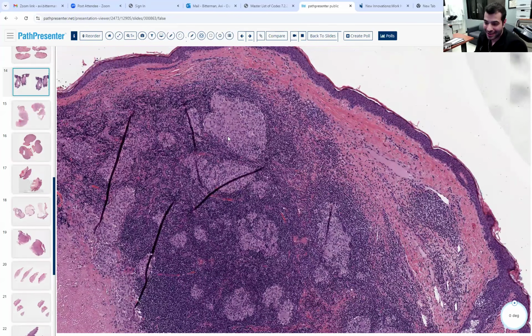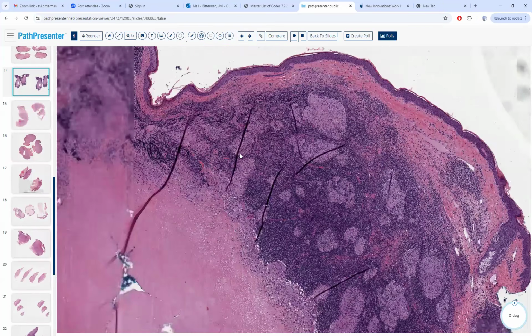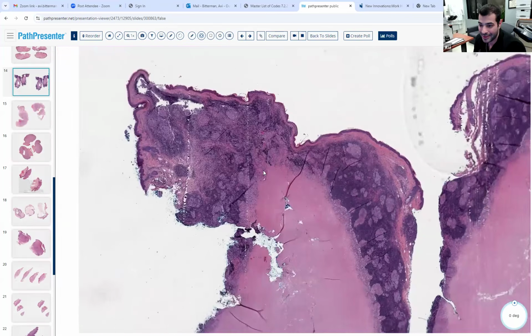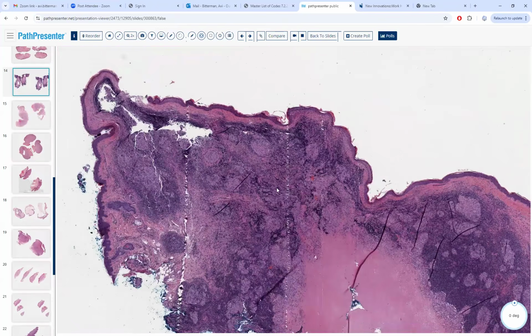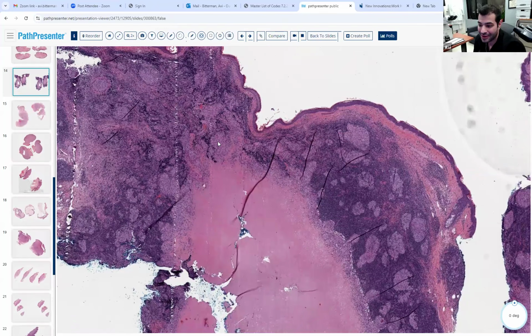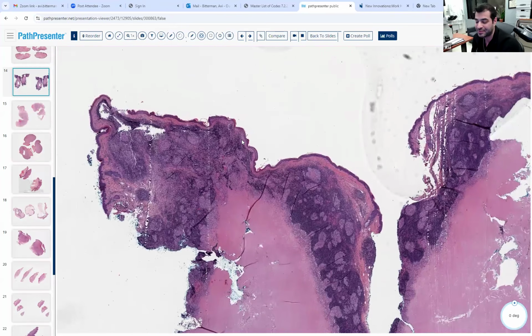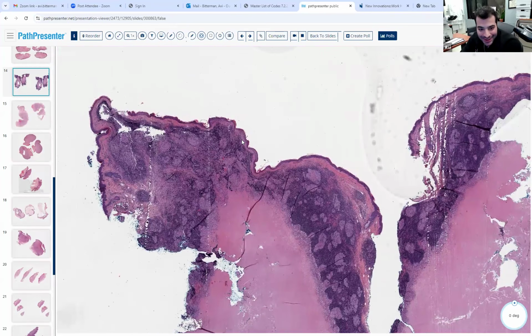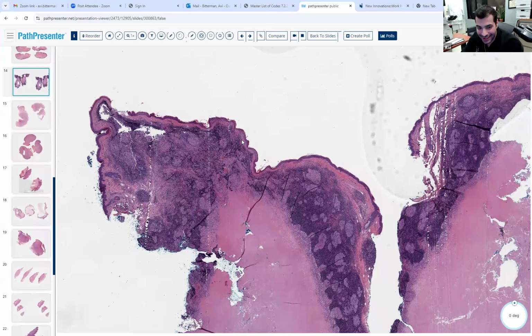So what kind of non-sarcoidal caseating granuloma is that? Tuberculoid. Yes. So what might we be thinking here? Tuberculoid leprosy, or acute miliary tuberculosis. Miliary TB is usually not this large. It's usually more multifocal. It looks more similar to what other entity, by the way? LMDF, lupus miliaris disseminatus faciei.